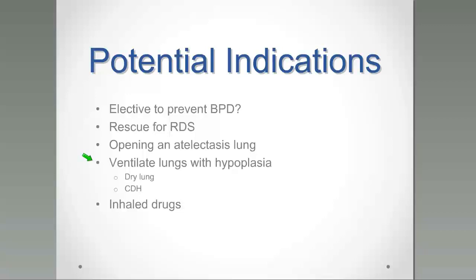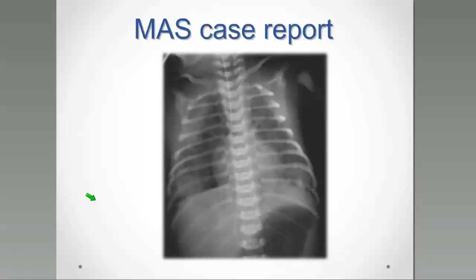And remember that if we open the lung and keep the lung open all the time, it's easier to deliver some kind of inhaled drug, such as inhaled nitric oxide, to this baby. So many times it's easier to open the lung before using high-frequency ventilation than conventional.